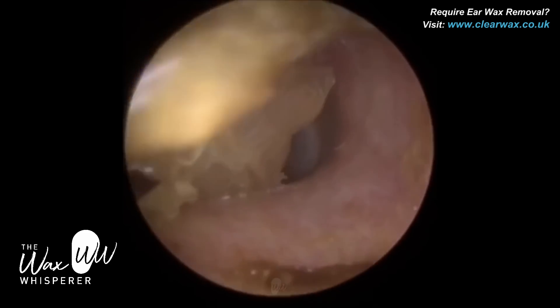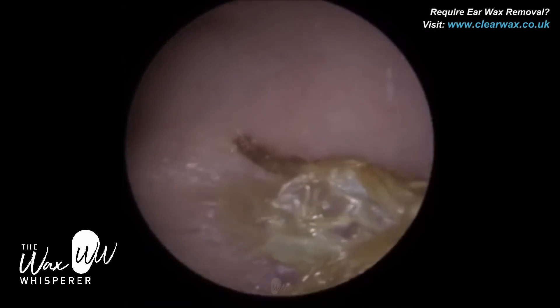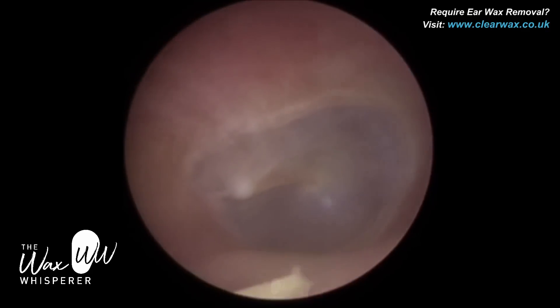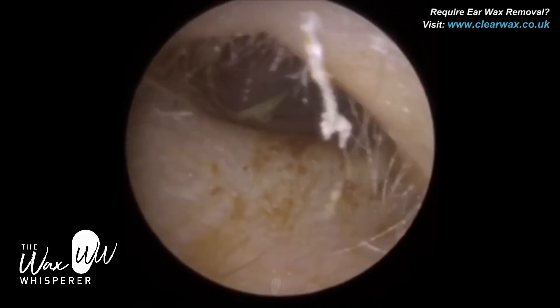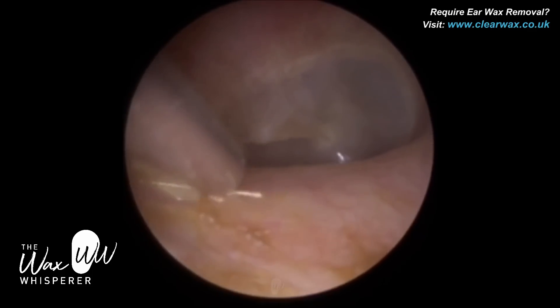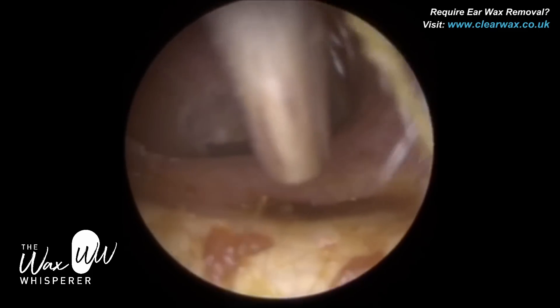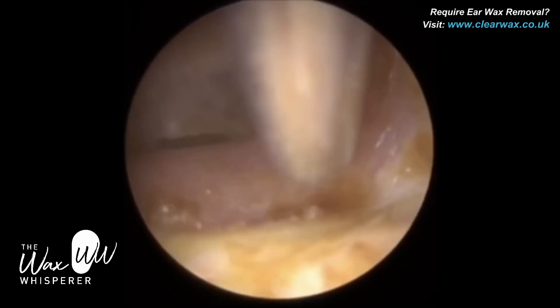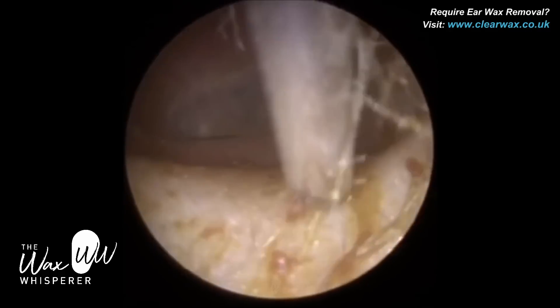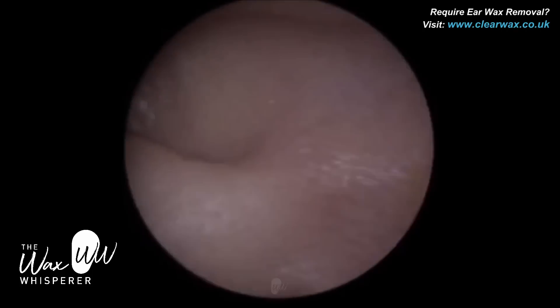Does that cause an issue for the patient in terms of earwax buildup? Possibly no, because earwax — the dead skin — generally migrates downwards. So in fact, you could argue that having a more inclined ear canal will facilitate the natural migration of dead skin and wax out of the ear, because near the entrance is the downward trajectory. So gravity can facilitate in removing this wax. Everyone's different — we have individual differences. I'd say this patient's ear canal is just a bit more upwards, more of a steeper slope, but I wouldn't say it's a contributing factor towards the wax buildup.